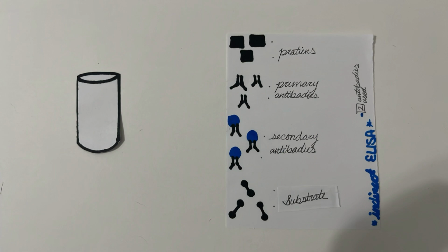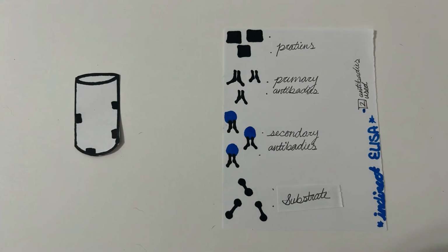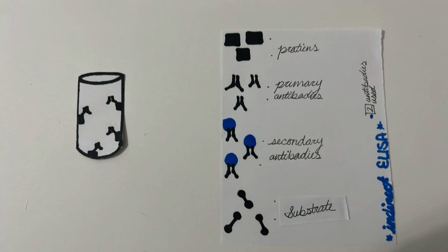The ELISA testing first starts off with an experimental sample being added to the wells. In the sample, the proteins will bind to the walls of the well. After they have bonded to the walls, detergent will wash out the unbound proteins in blocks. Primary antibodies will be added to the well, which will bind to the specific antigen in the wells. The remaining primary antibodies will be washed away.